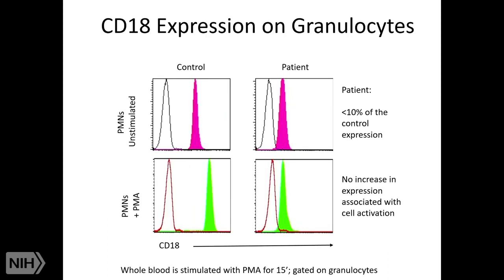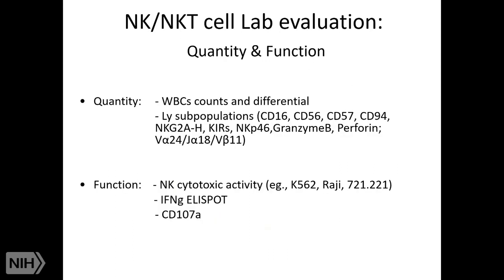This is another disease, more rare, leukocyte adhesion deficiency, expression of CD18. NK cells, I'm going to move forward. Very interesting cells.